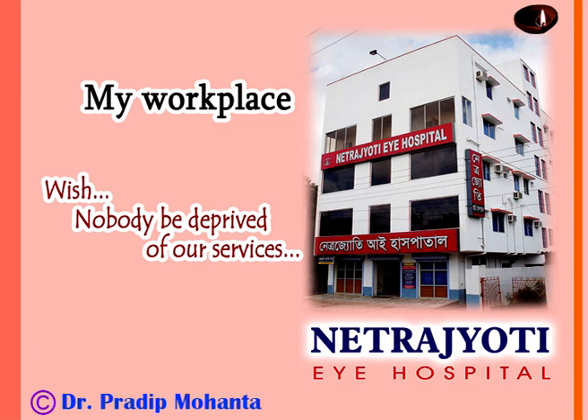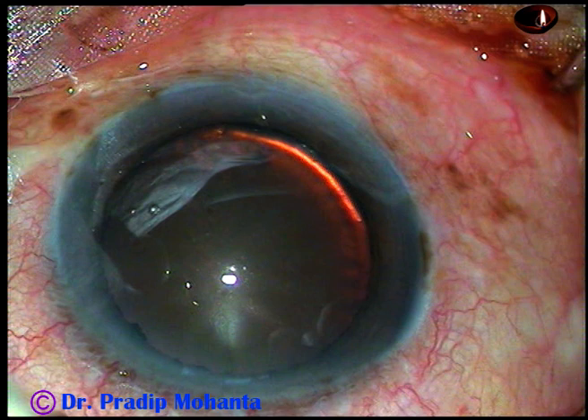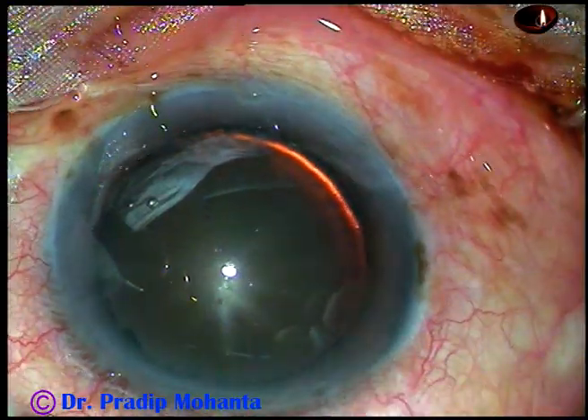Dear colleagues, welcome to my workplace at Ranaghat, West Bengal, India. In this video, we will see how to place a CTR in a subluxated cataract.